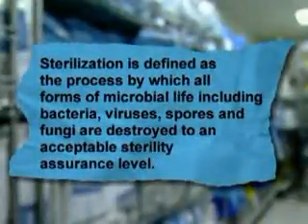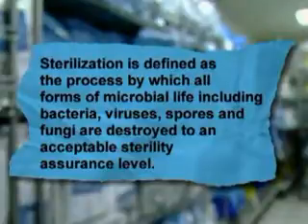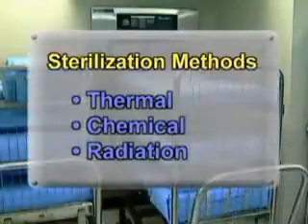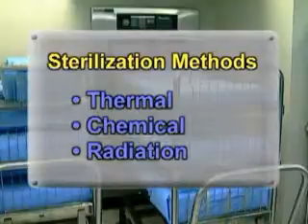Sterilization is defined as the process by which all forms of microbial life, including bacteria, viruses, spores, and fungi, are destroyed to an acceptable sterility assurance level. Sterilization methods include thermal, chemical, and radiation.